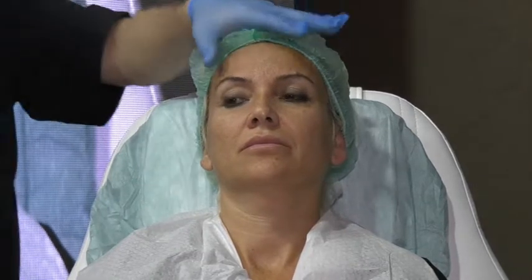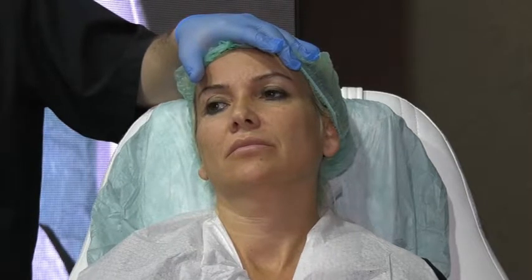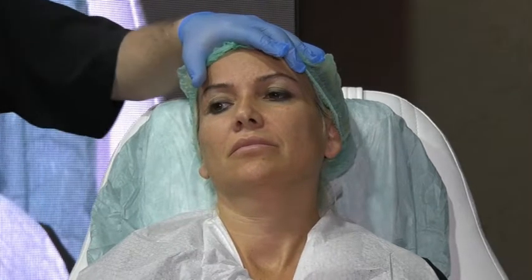I'm telling the patient with my finger, do you like that? Do you like that? Anywhere she wants, I'm going to choose as the central vector. So, there is only one point I cannot put the threads in. Which point can I not put the thread?